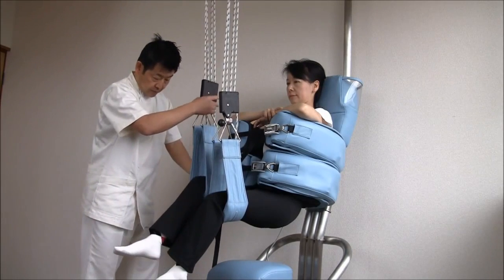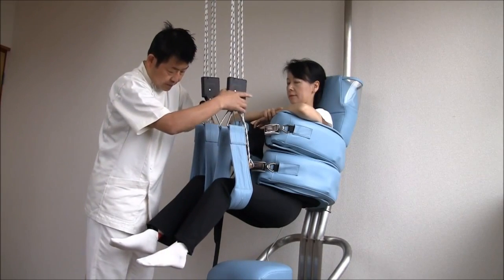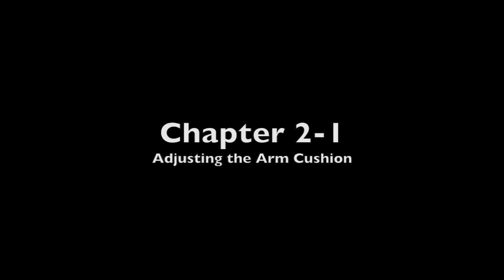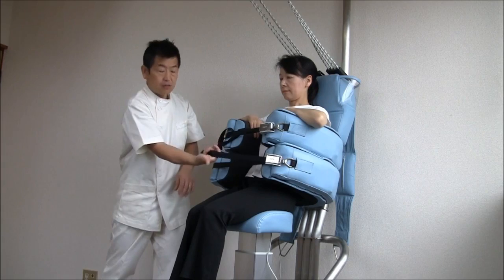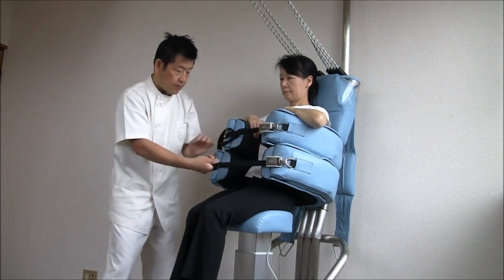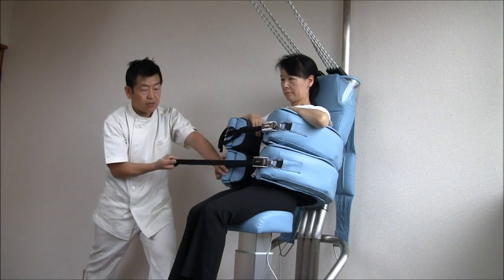Ask the patient what knee height is most comfortable for you. At this time, it is not necessary to have their knees parallel to the ground. Do not pull the belt. You must push the cushion while pulling the belt to tighten it.